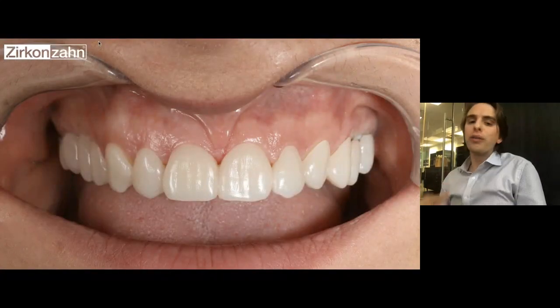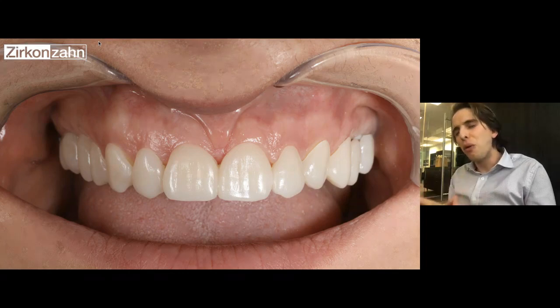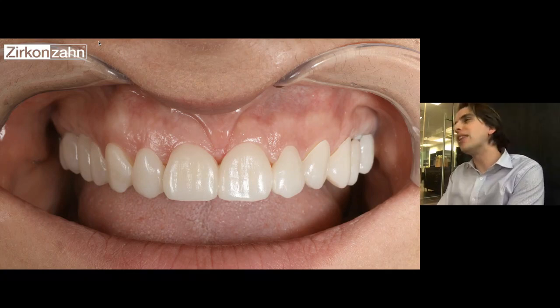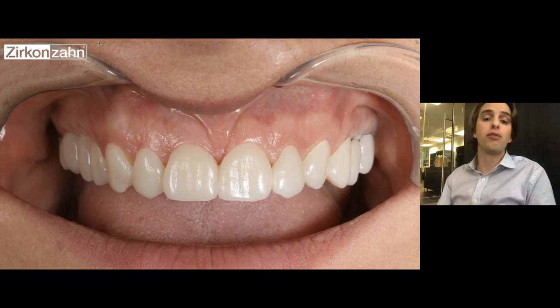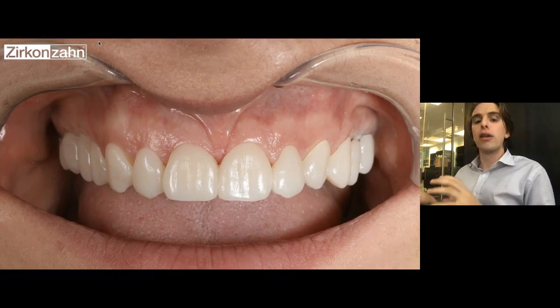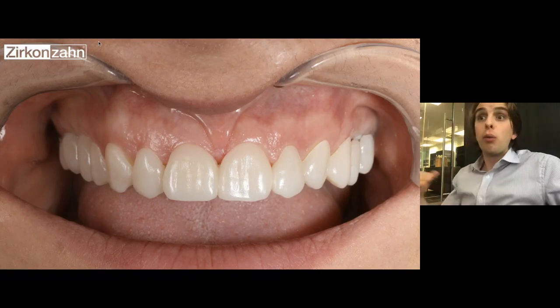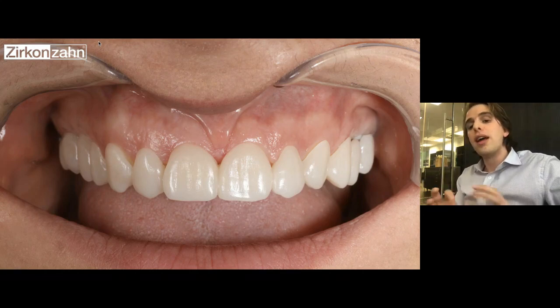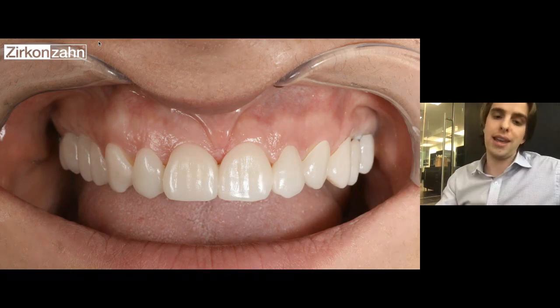And we can use this not only to make the patient comfortable with the treatment that we are ultimately looking to provide, but we can use this more importantly for a functional assessment and an aesthetic assessment prior to an invasive therapy. And I believe that this is an amazing service that laboratories can provide their clinicians when going after full mouth rehabilitations, to be present in the clinic, to capture these records, and to come back and deliver a simple mock-up that the patient can go home and wear. We are selling the patient into the case while getting very important clinical feedback prior to an invasive therapy. And I think that the doctors will really see the intrinsic value in this type of service that we offer them. And it really strengthens our interdisciplinary collaboration as we go to do more cases together.